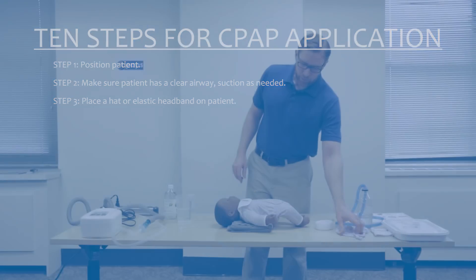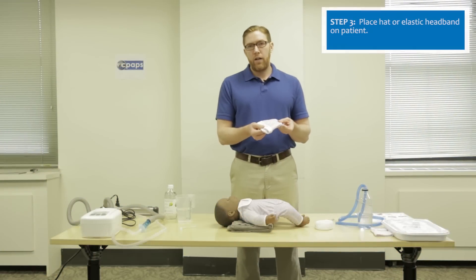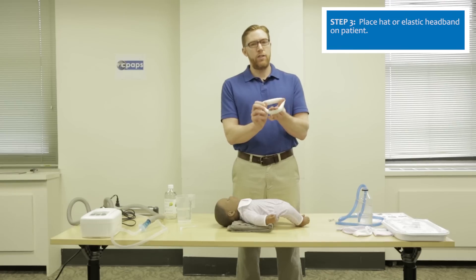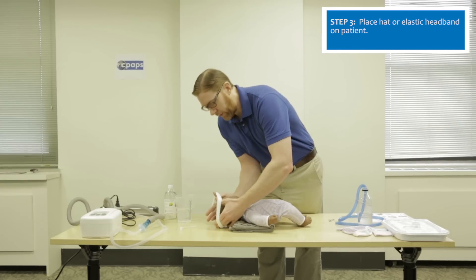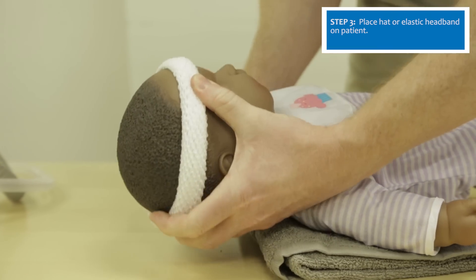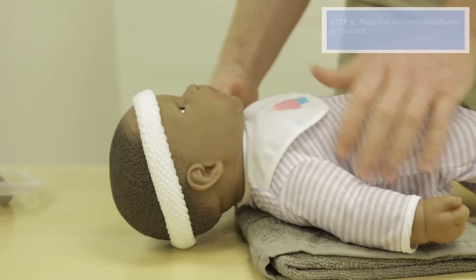The next step is to use a hat, cap, or elastic band to secure the CPAP tubing. Carefully place the elastic bandage around the patient's head, being careful to avoid obstructing the eyes or the ears.